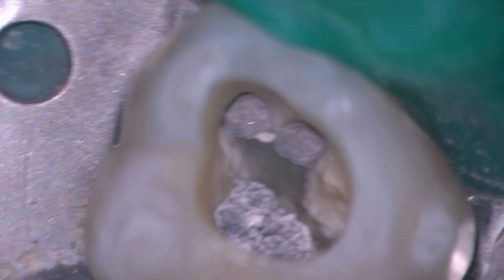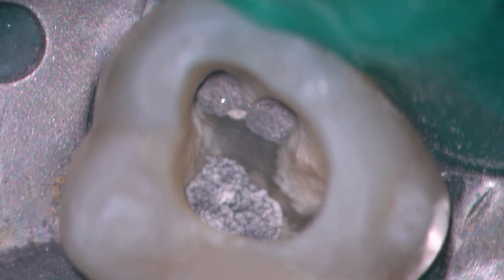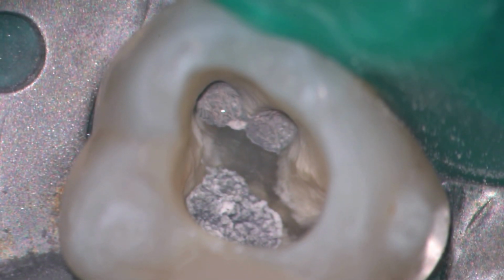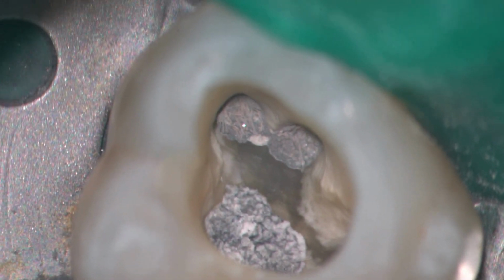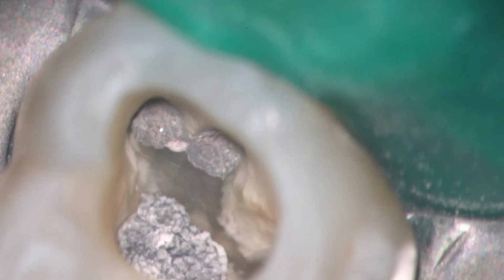I place a UV shield over my microscope lens to make sure I don't scratch it when I do the micro etching. So I basically just etch until I make sure that all the debris is off the walls, and especially the cavosurface margin of the prep. There you can see the sandblast particles in the soft surface layer of the gutta percha and the Cavit.